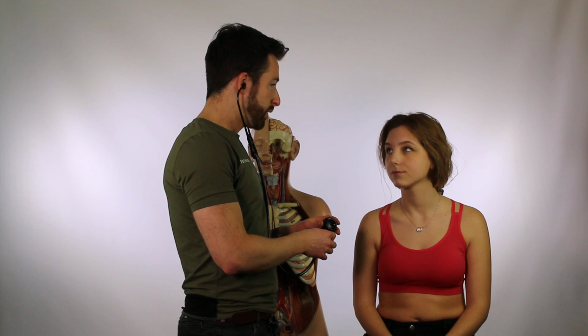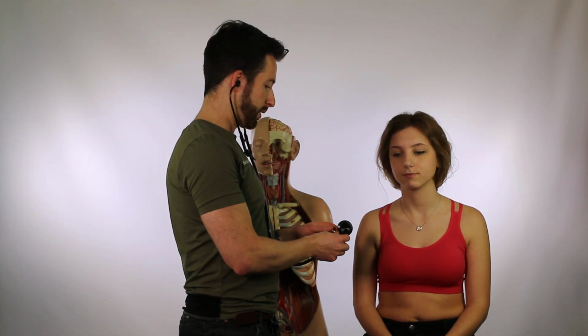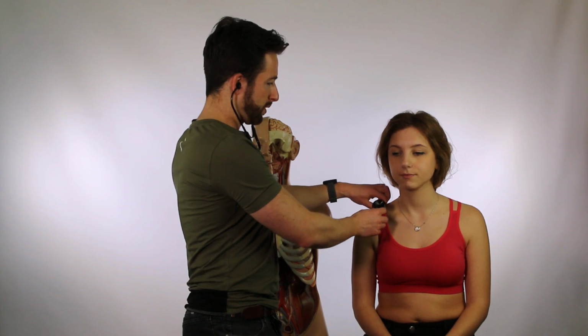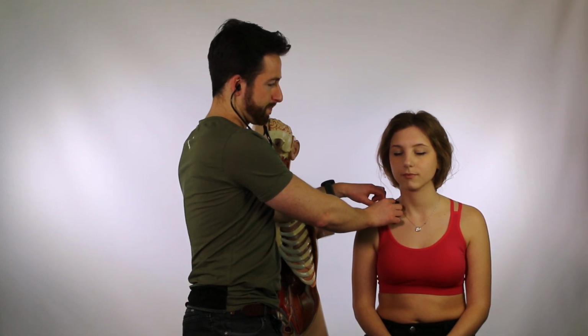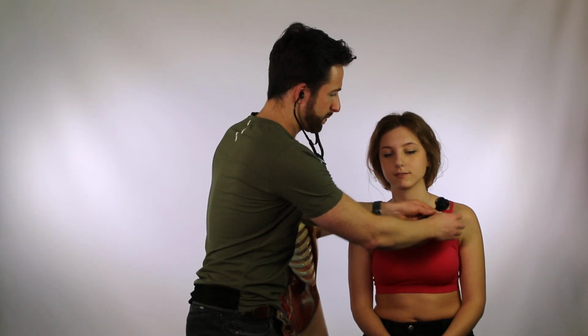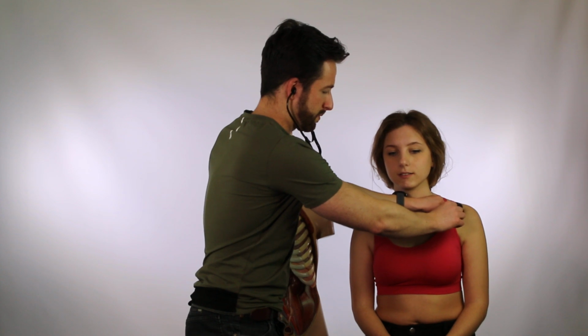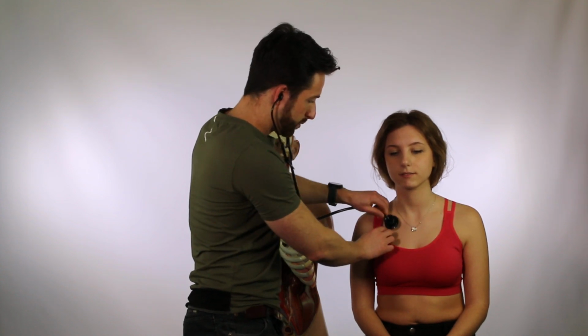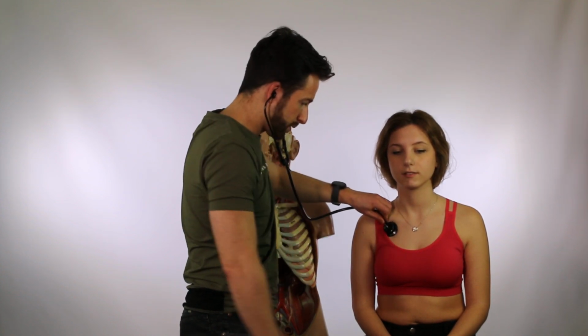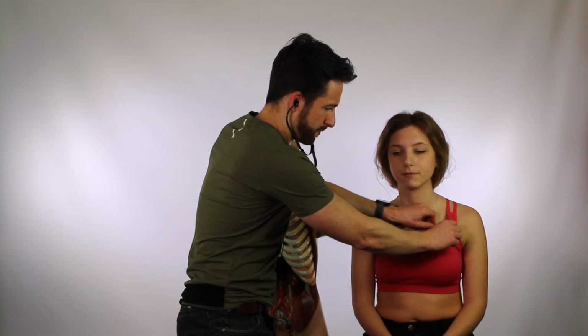So Hannah, can you please just breathe in through your mouth and out through your mouth with an open mouth? Okay. So I'm going to do the apex and the other side. Good. And just second intercostal space. Okay. And the third.